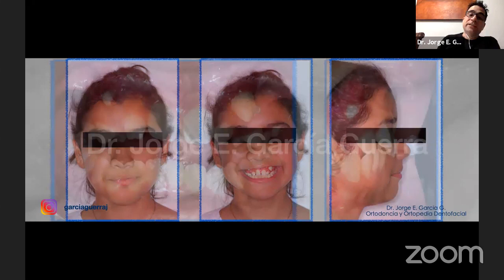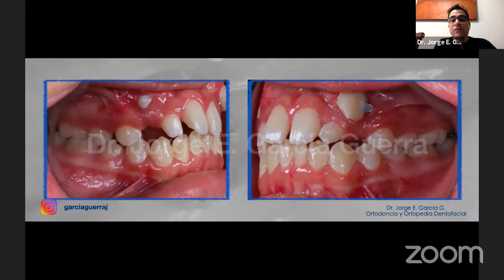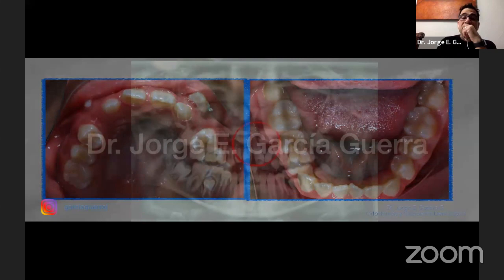They're already out. So once we have this situation, our treatment's going to be much easier, okay? Now you can see we need to be very careful with the roots of the incisors because of the resorption that it had, and with the root of the lateral incisor because it's a very small and thin root. But we can see this from the advance when we started.